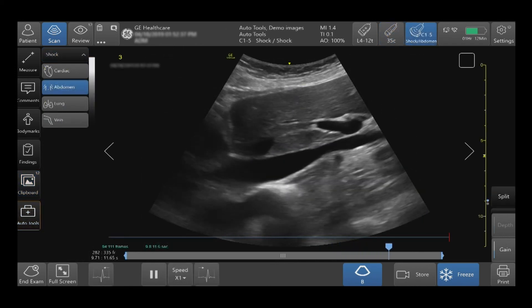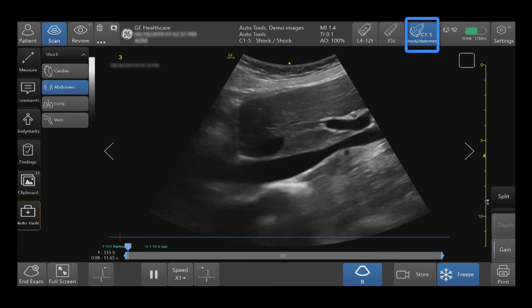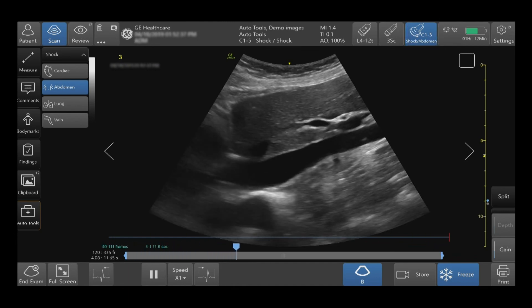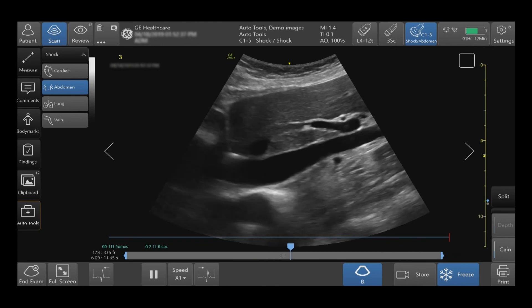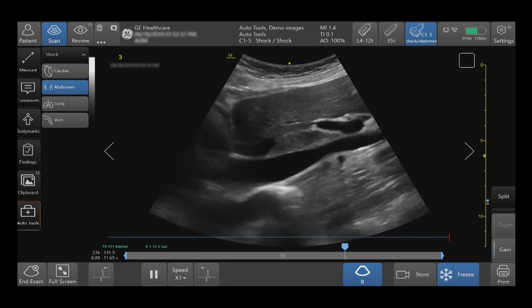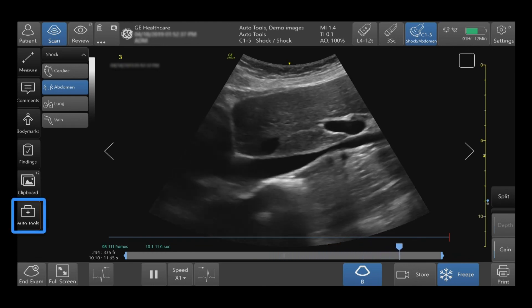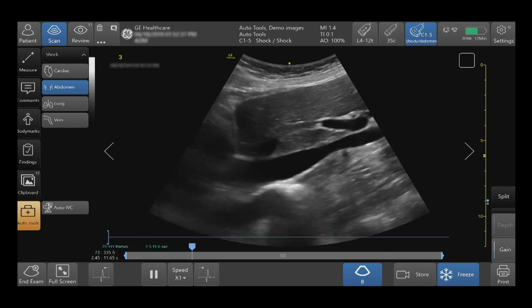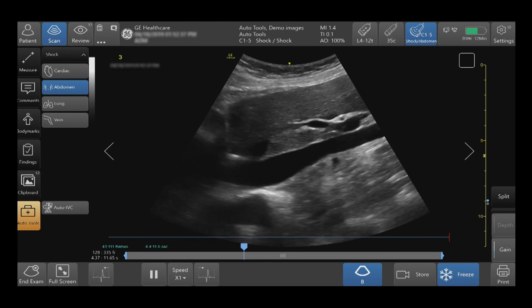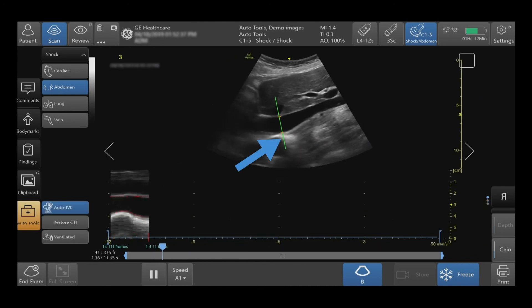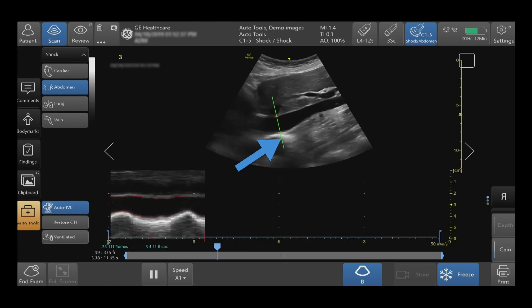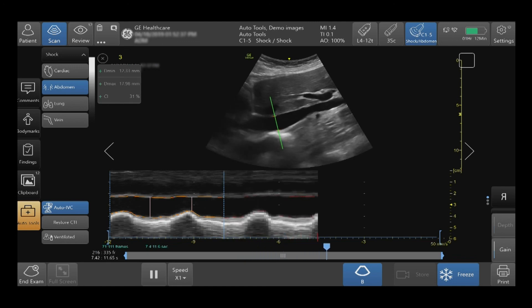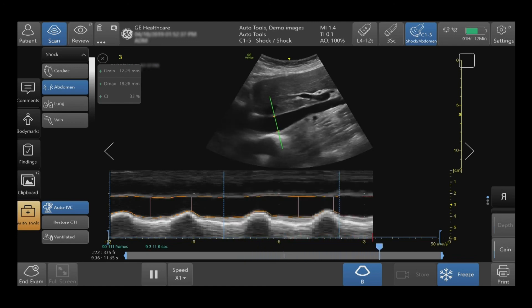In order to use the Auto IVC tool, select the correct probe and preset, using B-Mode imaging to demonstrate the IVC in long axis as demonstrated here. Select the Auto Tools tab in the bottom left hand side of your touch screen, then tap Auto IVC. An automatic caliper will be placed in your proximal IVC. When green, the results are highly likely to match calculations created by an expert.